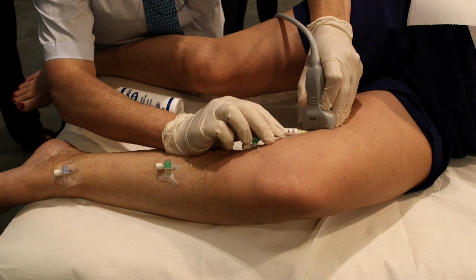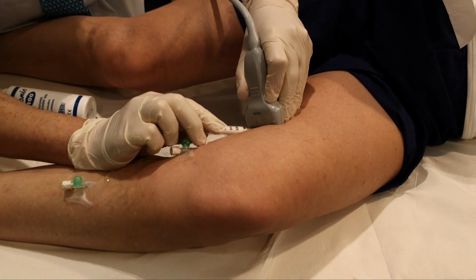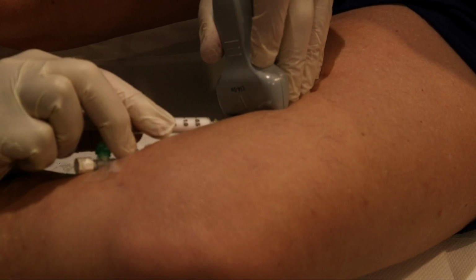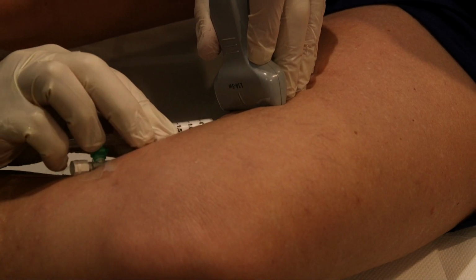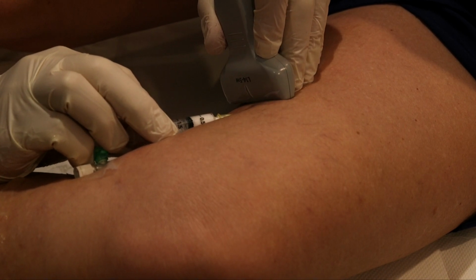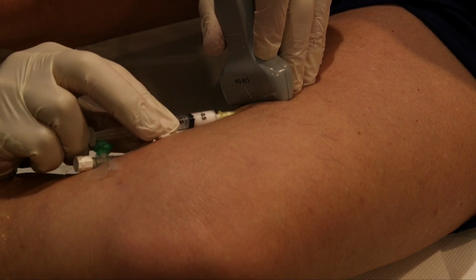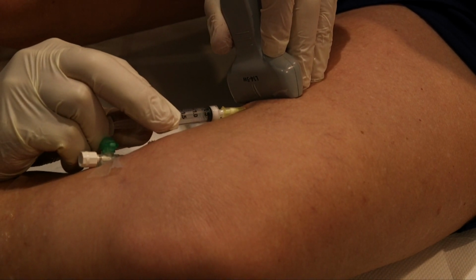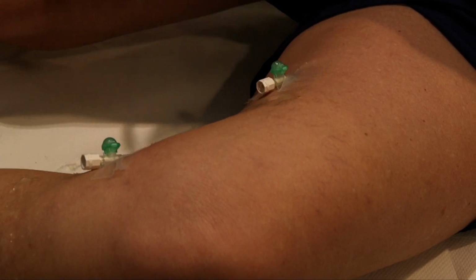Injection in here then. I'll go with one more, yeah. So here I am trying to put the needle in that vein there and then inject foam. We'll just gently drift a little bit of foam in here, because I think this is one of the things giving rise to the varicose veins, and it may or may not get filled when I inject the saphenous trunk. Okay, that's good.